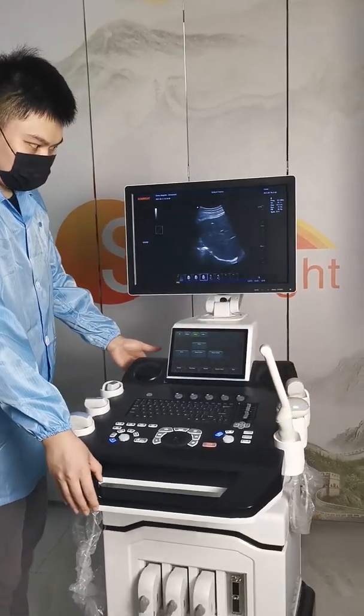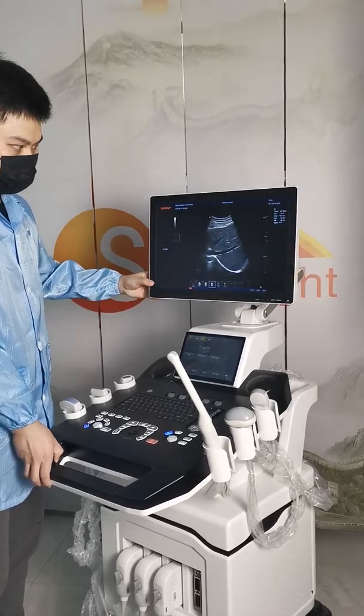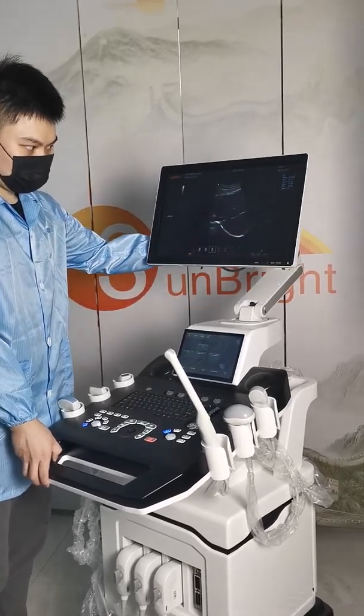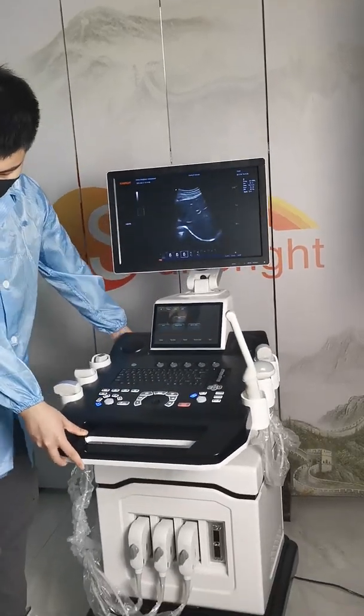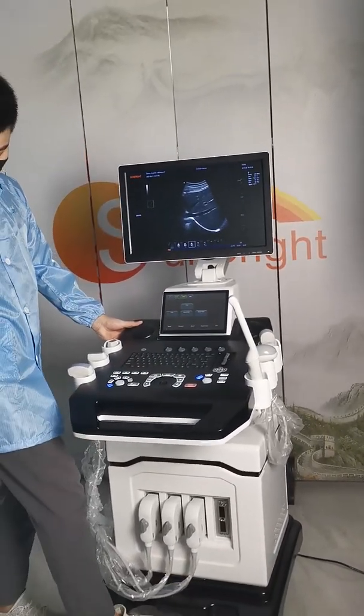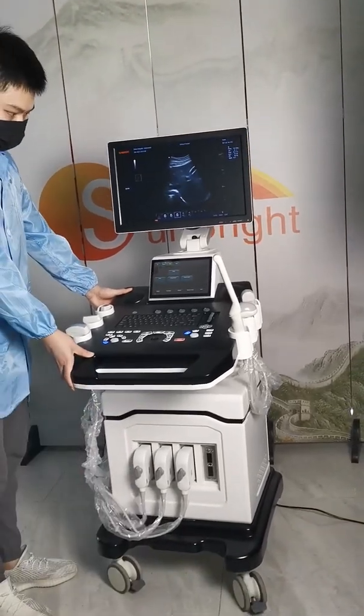The screen is movable. You can rotate it to different angles. It has two locks which you can use to fix the position.